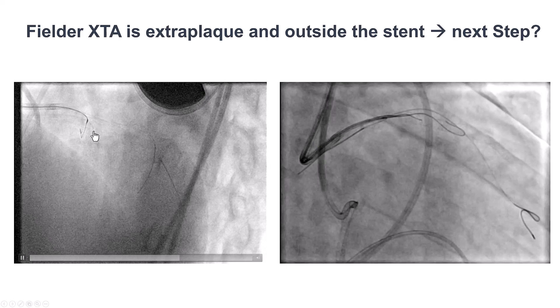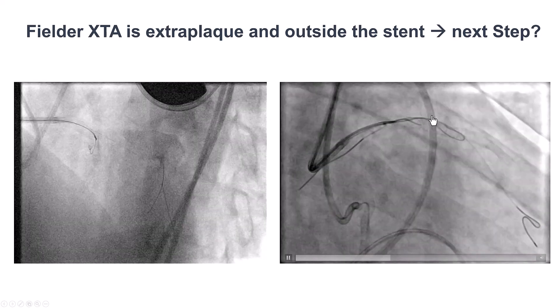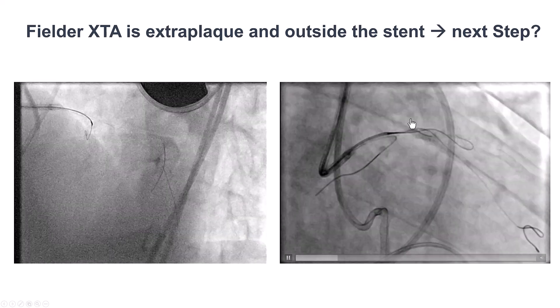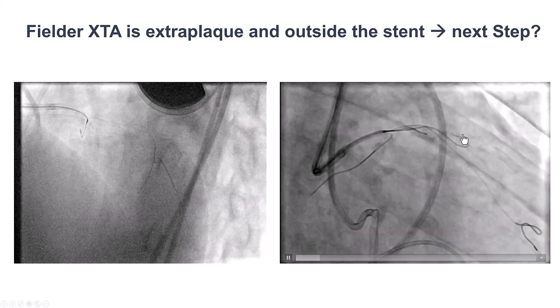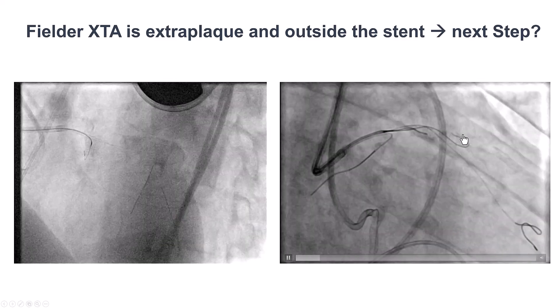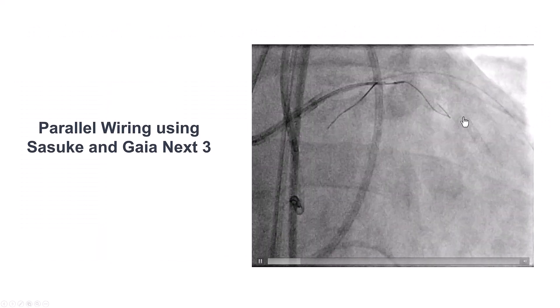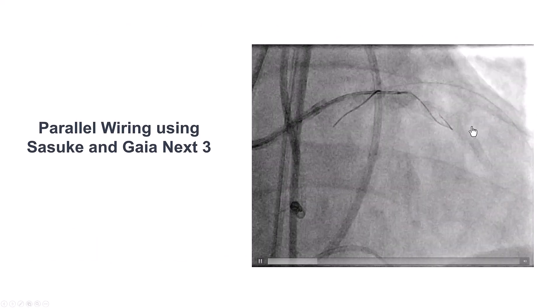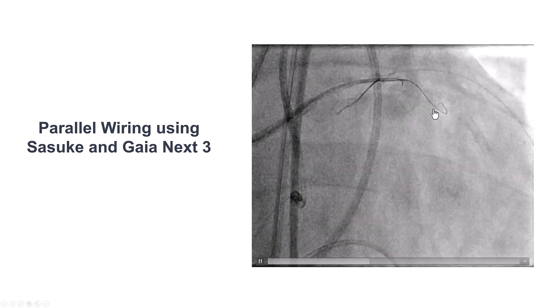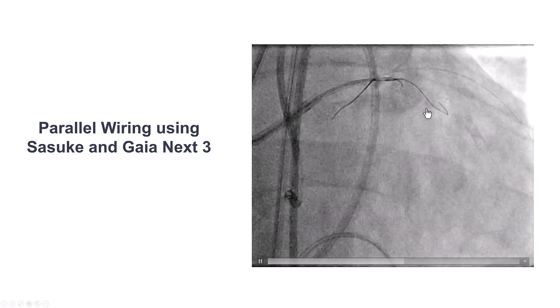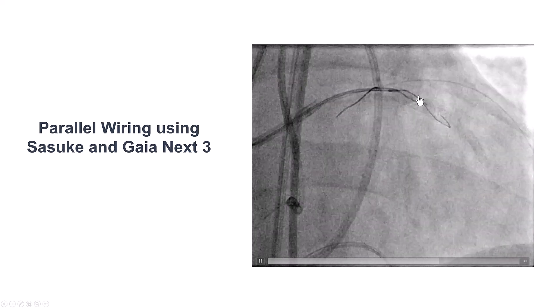But unfortunately, despite de-escalating to a Fielder XTA, we found that the Fielder XTA was actually following a course outside the previously placed stents. One option is to knuckle all the way and then re-enter, but because this is the LAD, we don't want to lose any potential large side branches like diagonals. So that's not a good option.